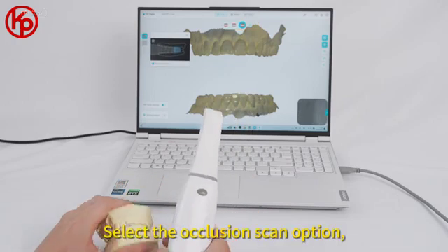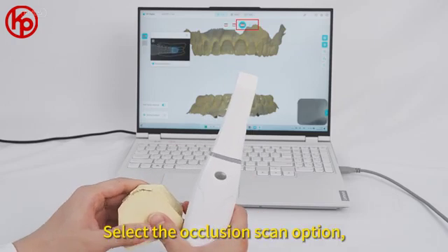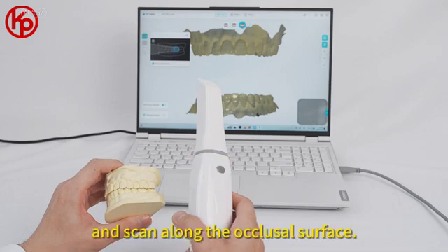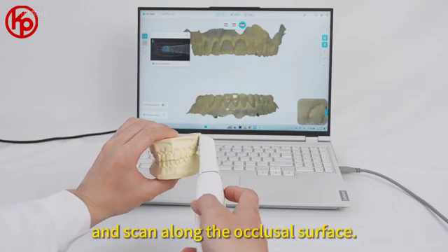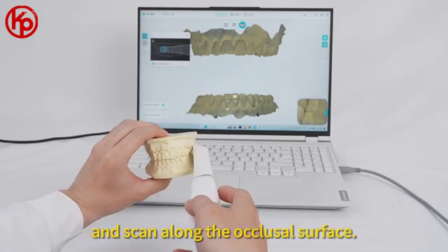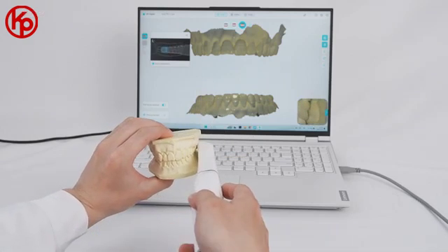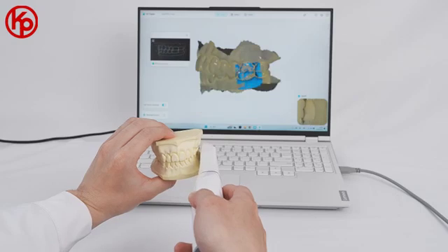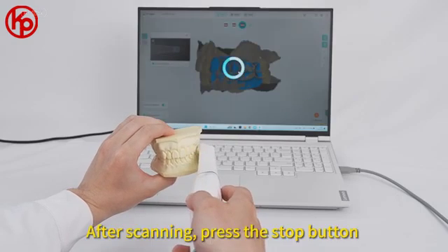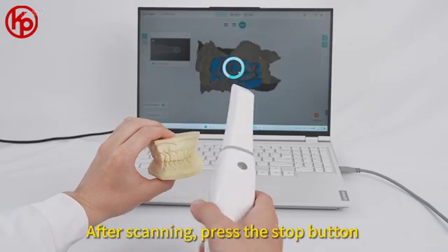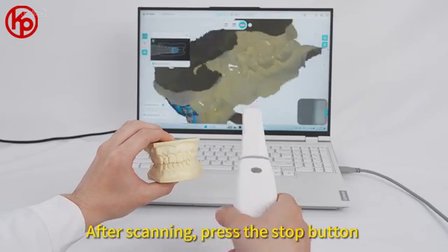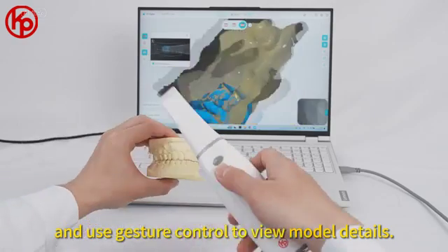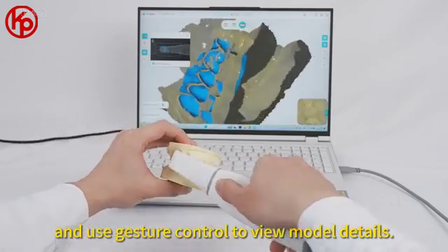Select the occlusion scan option. Press the start scan button and scan along the occlusal surface. After scanning, press the stop button and use gesture control to view model details.